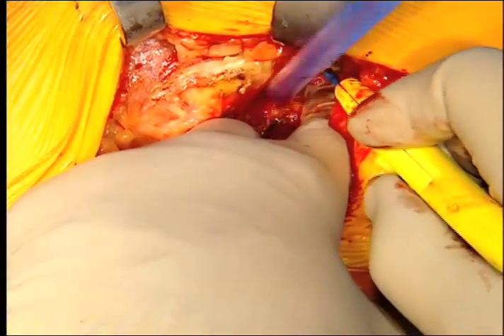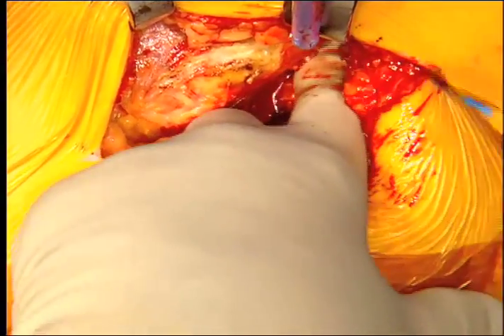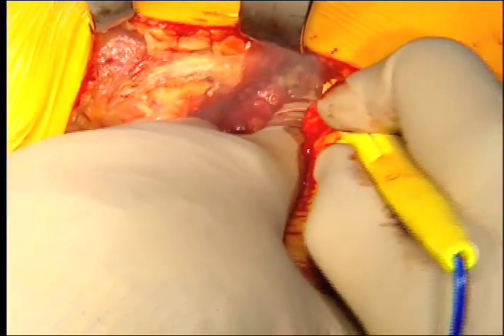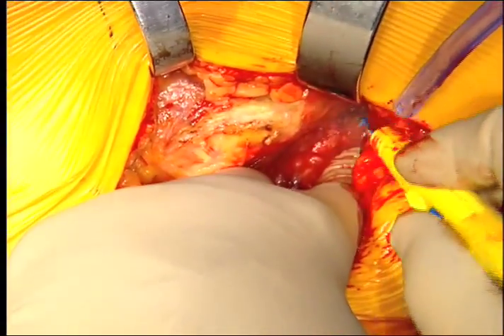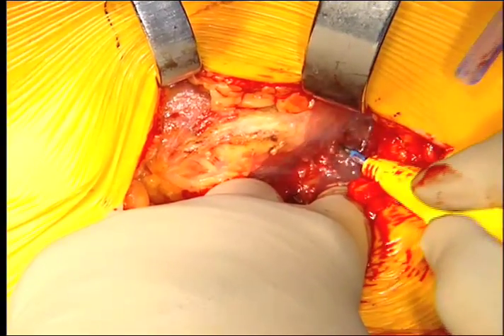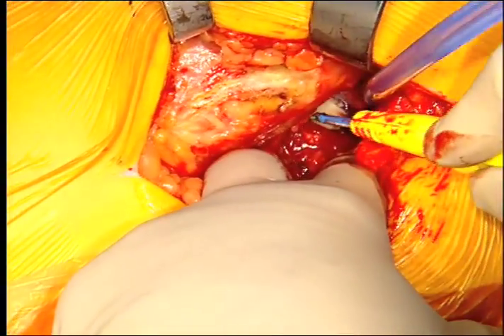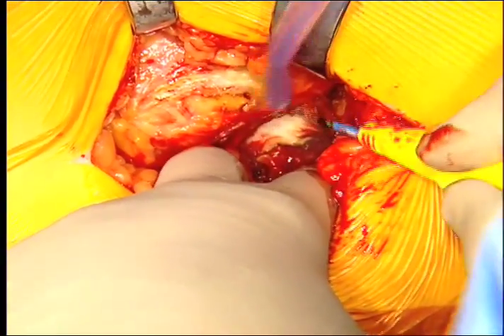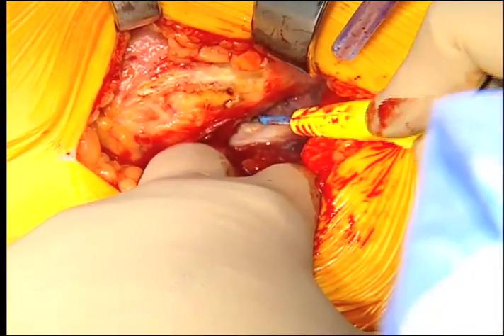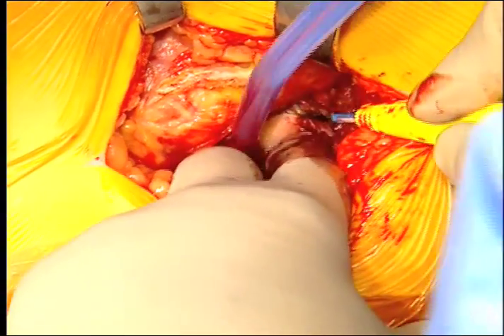We're sparing the piriformis in this procedure. It's right here under my finger with fat over the top of it. There's the piriformis — you can see a little bit of the white of it. I'm going to come up directly parallel to it, right down to the bone, and then make an L-shaped incision. I'll save the quadratus also. You can see the capsule now — opening it, with the gemelli on top, and now you can see the femoral head exposure.